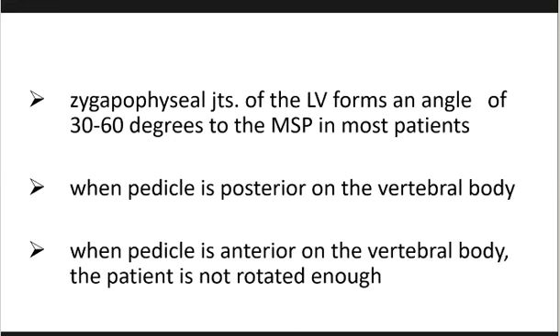Pero kung ang pedicle ay makikita anterior, or when the pedicle is located anterior to the vertebral body, in other words, ano naman ang kulang doon? The patient is not rotated enough. Diba?